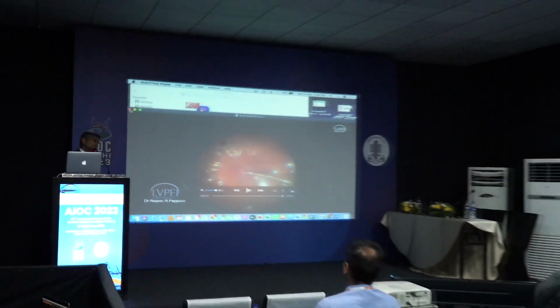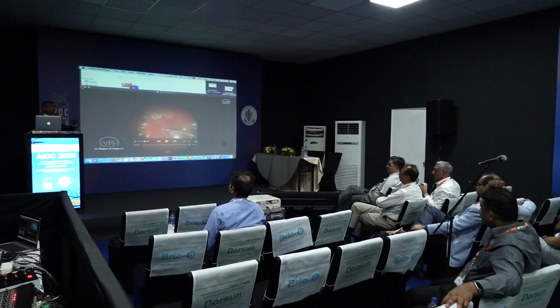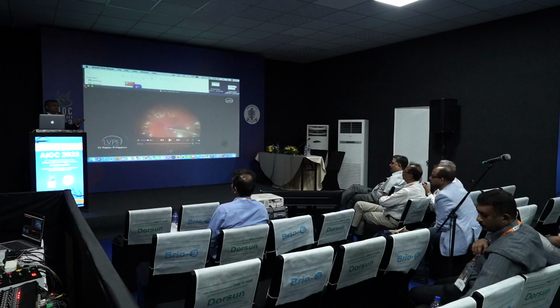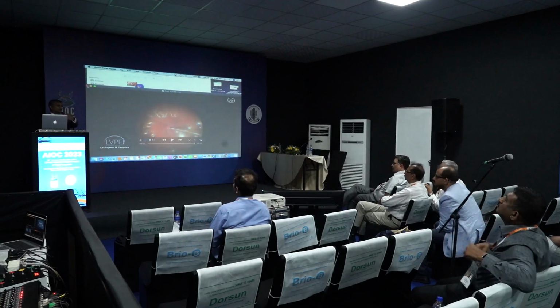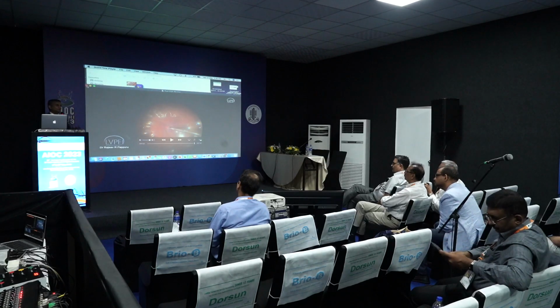But I could have done the laser at the first instance, but I didn't want to do an extra. So now it is like I've done a staged laser for them. This side I've already done because of the GRT. The other side I've done now because there was a break, and then I extended it further.